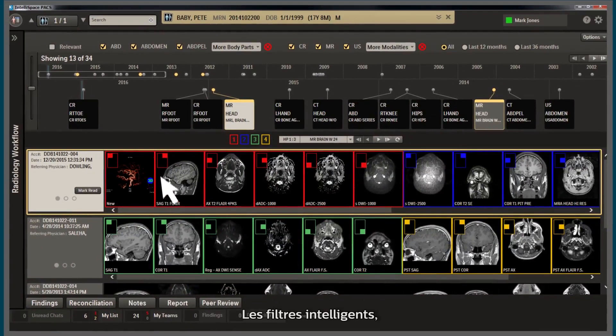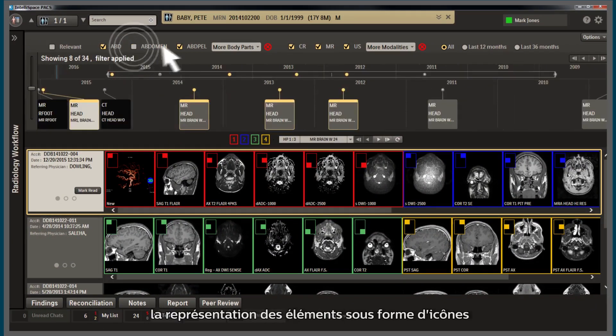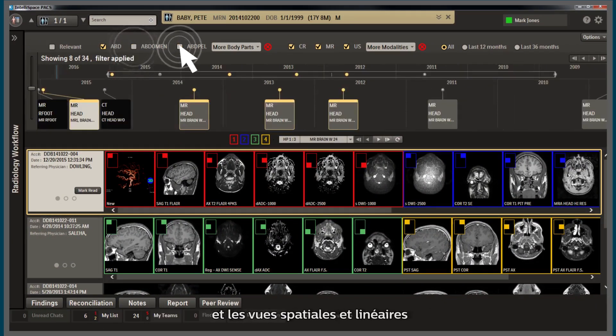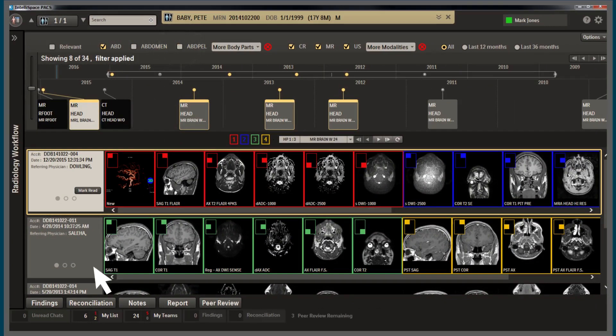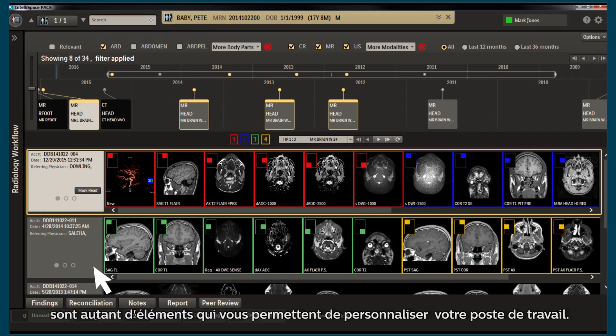Smart filters, color coding, icon representation, linear and spatial views — all with the ability to personalize for your workspace.